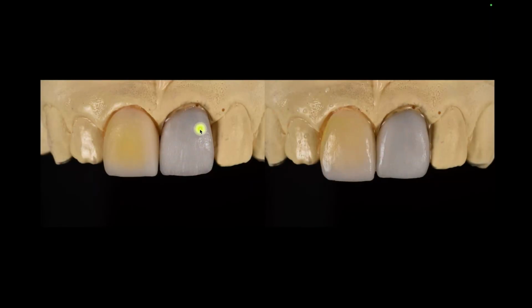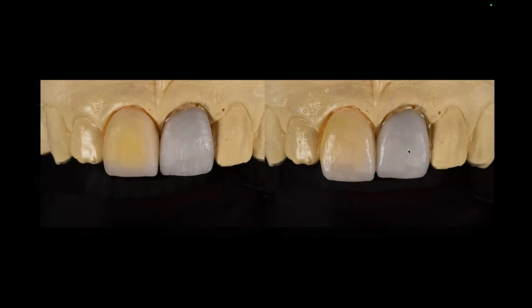So this is where monolithic materials become so challenging, right? Because even in the more opacified ingot, I'm still getting a lot of gray bleed through. And by the way, that's a 0.5 millimeter coping there. So a 0.5 millimeter MO, most opacified ingot, I'm still getting bleed through. Now, hopefully it won't be as bad in the mouth.